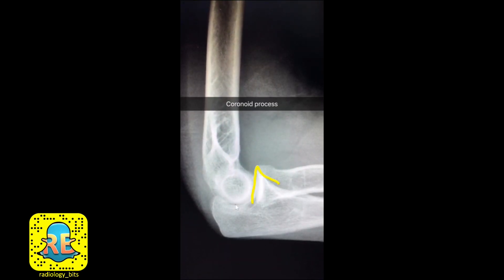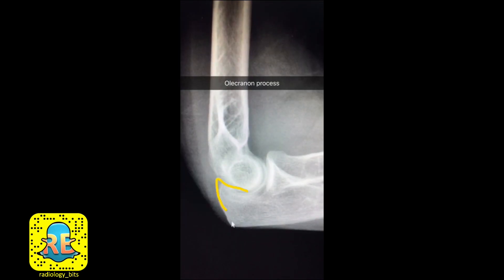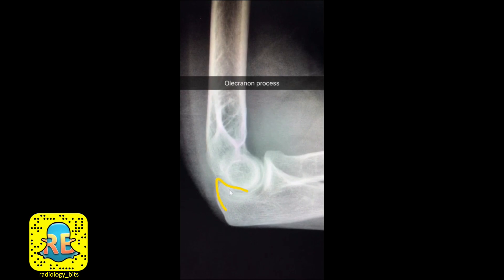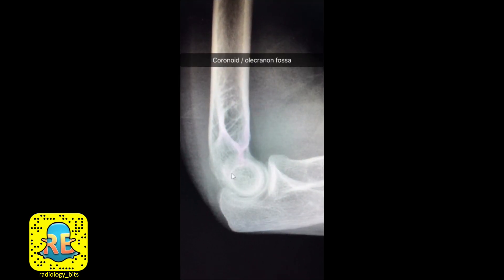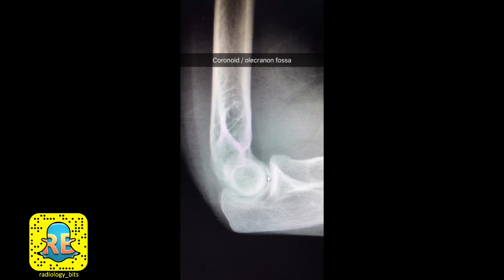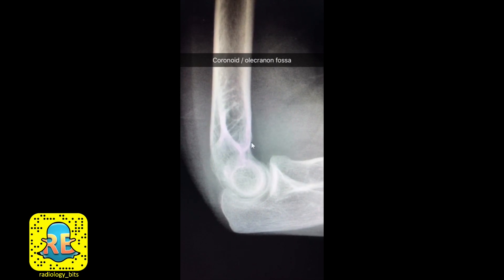Now let's look at the ulna. You have this anteriorly pointing projection — the coronoid process — and this posterior pointing part — the olecranon process. What's left in the humerus: there is a depression anteriorly for the coronoid process to fit in, and a depression posteriorly for the olecranon process to fit in. So this is the coronoid fossa and this is the olecranon fossa.